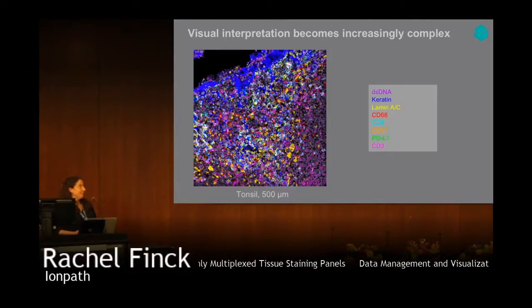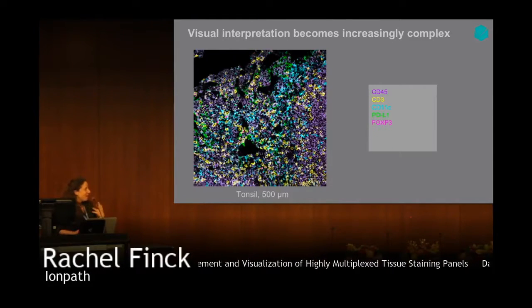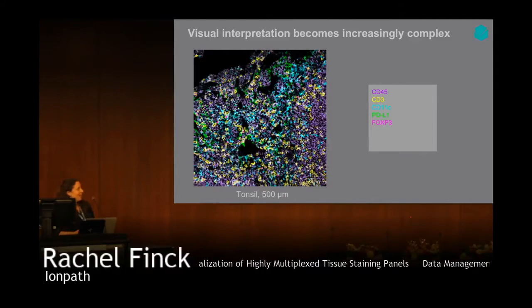Of course, it's diminishing returns at a certain point. And if you really are interested in PD-L1 versus CD3 and where they show up, you probably want to look at this view instead. And I think, in the interest of time, I'll skip some of my logic on exactly how and why we combine them in certain ways.